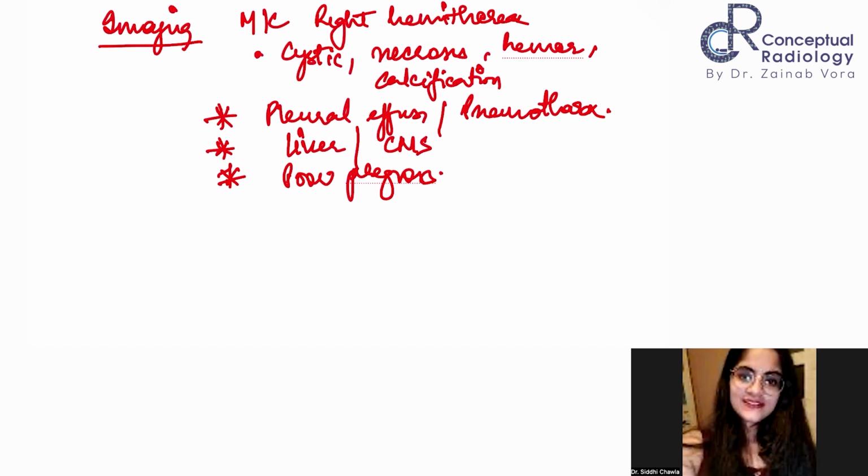Although pleural effusions are common in a pleuropulmonary blastoma, the important thing again that you should remember is that chest wall invasion is not very common. So this actually helps you to differentiate it from the other malignant lesions of the chest wall that we'll be reading in the subsequent lecture. So remember, it will be a large heterogeneous solid cystic mixed or solid mass which is occupying the hemithorax and will have a varied appearance, can have metastasis and has normally a poor prognosis. And chest wall invasion is not very common with the pleuropulmonary blastomas.